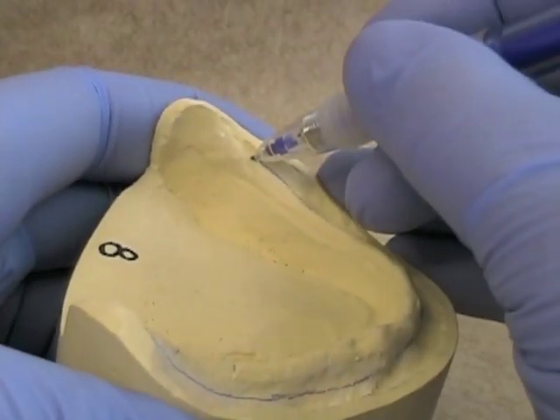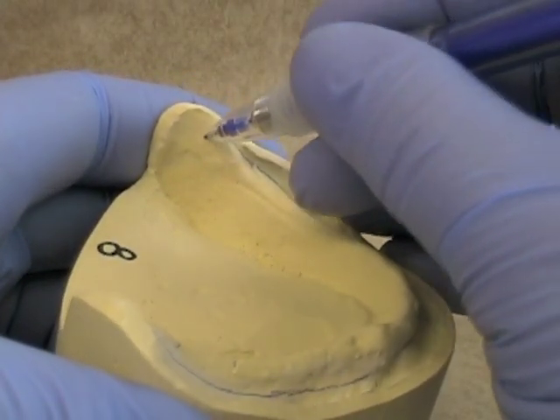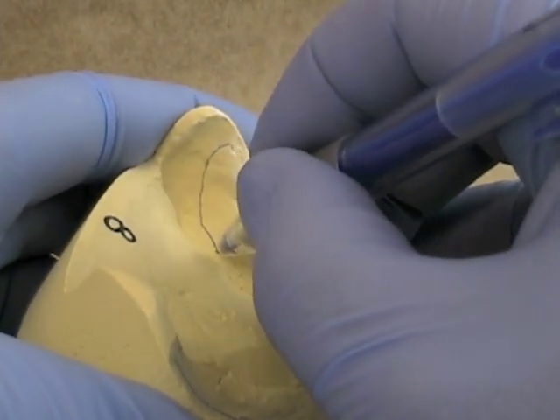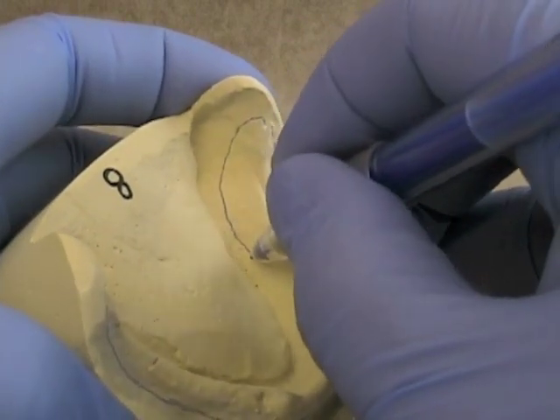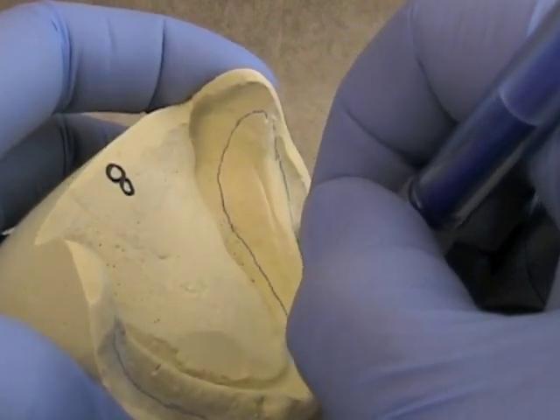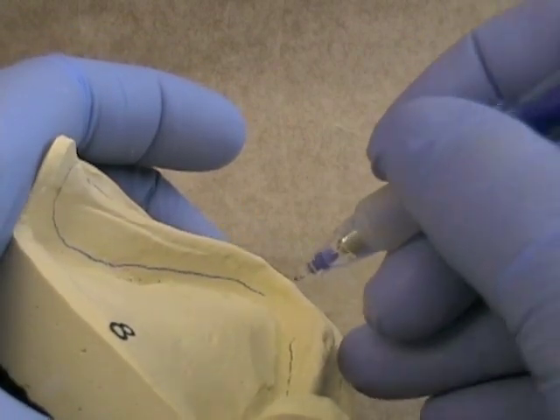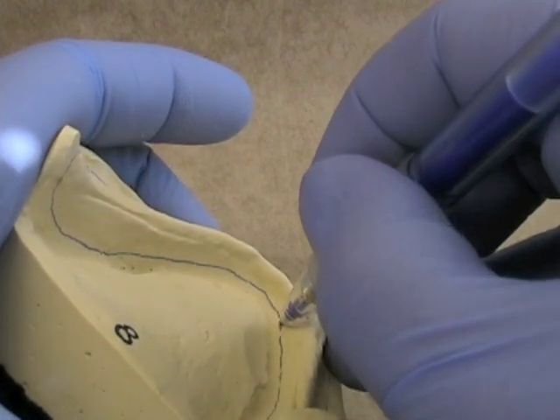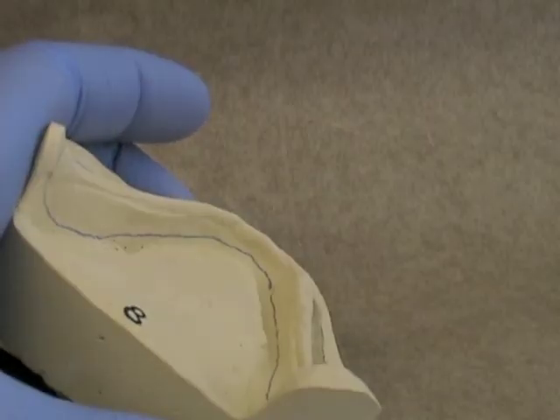Again, on this side over here, make sure we go up and cover part of the retromolar pad, and then coming down, and again, a little bit short of the depth of the vestibule. In this particular case, there's not a real prominent lingual frenum. In some cases, you may find that you have to move that up to provide relief for the frenum.